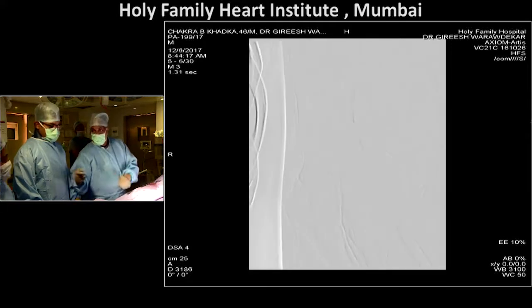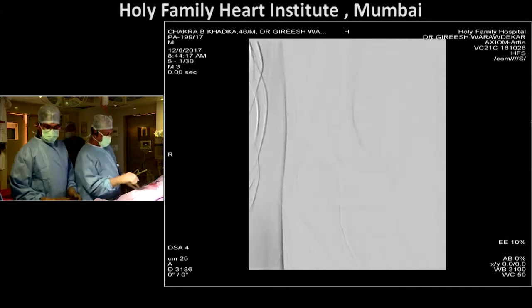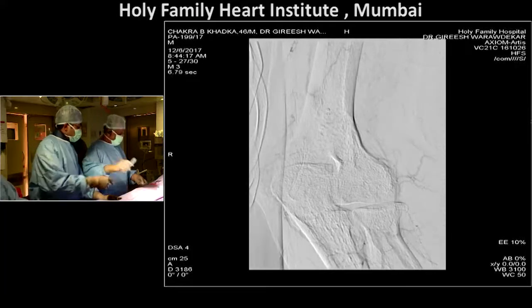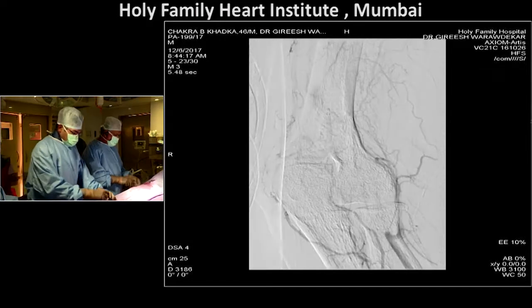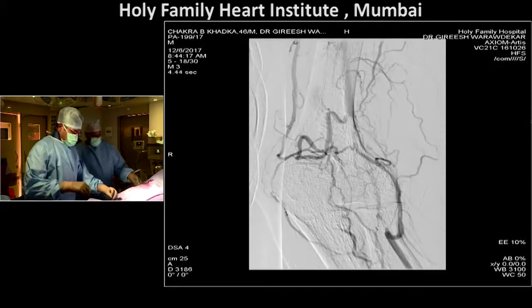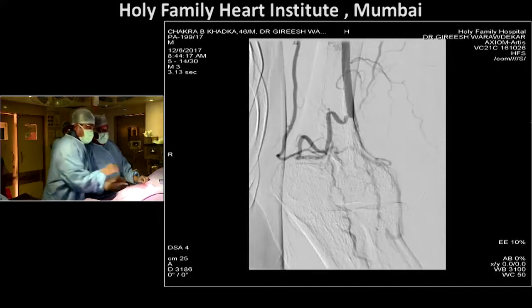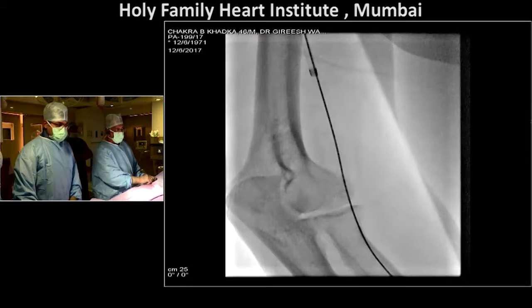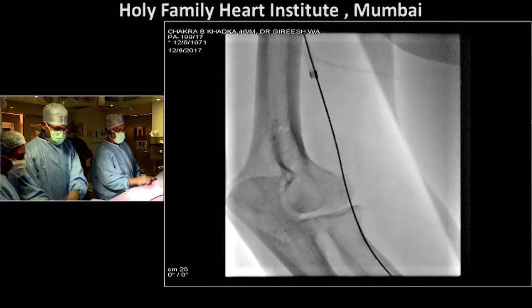I will leave it to the experts here to tell us what they think. It looks definitely like a chronic one. There are no plaques in the entire vessel. For that reason I think it's an embolic problem, because there are collaterals. I think it's an embolic chronic problem. And we need to check the heart for a source of embolus or something like that.